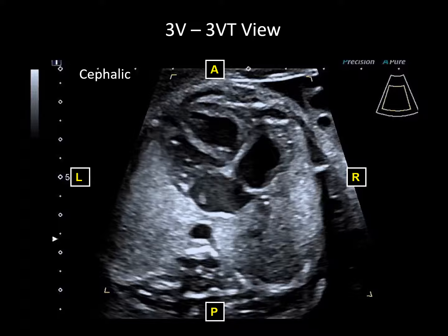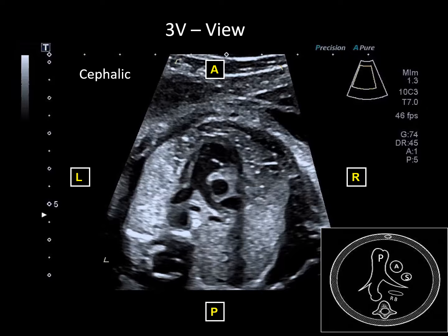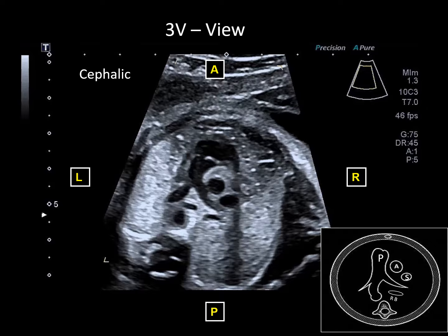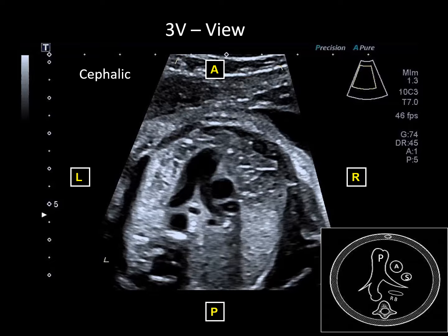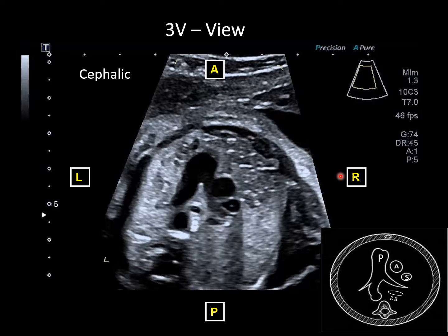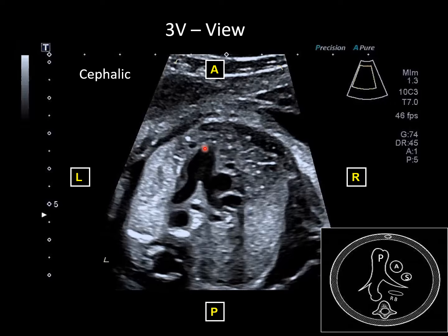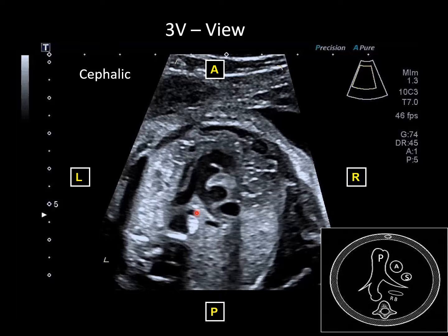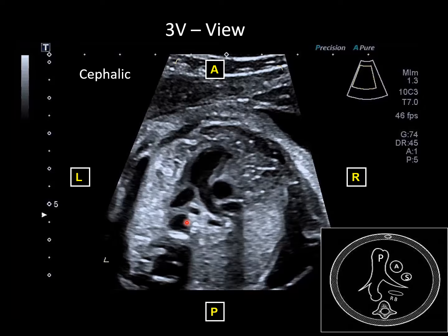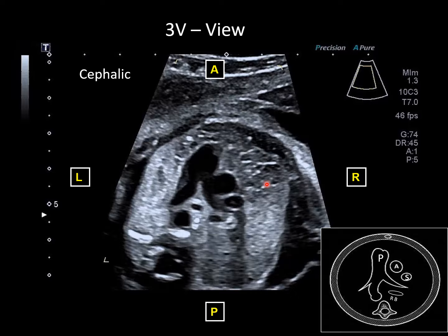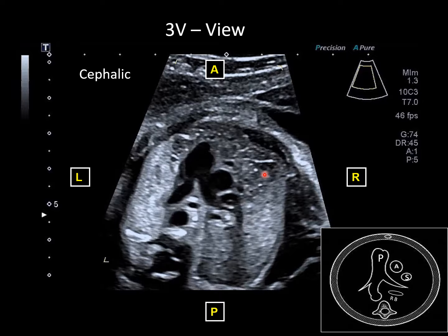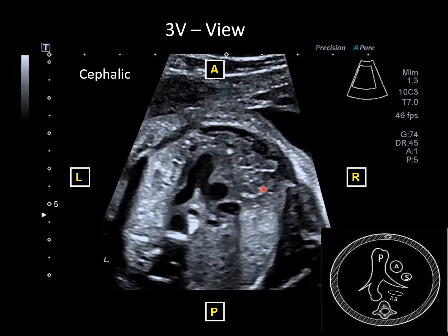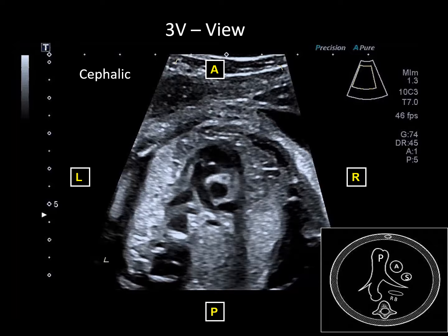As we settle in on this view in the upper chest and watch it with a nice long cine clip, you can clearly see all the structures: the SVC on the right, the aorta next, then the pulmonary artery with a nice bifurcation of left and right pulmonary arteries. Part of the right and left bronchi are shown beyond the carina. The descending aorta is visible behind. The thymus shows up clearly in front of the vessels — an important feature to identify in the fetus. This is a great example of a three-vessel view with a perfect clear image through the upper thorax.